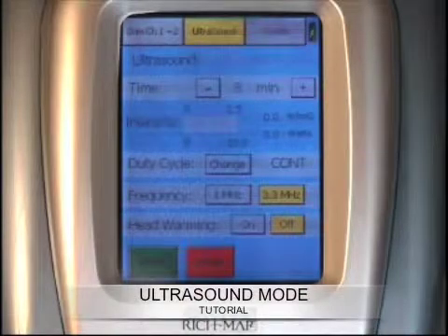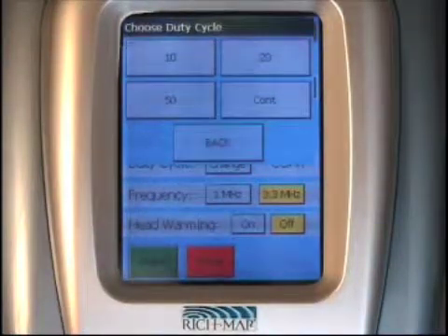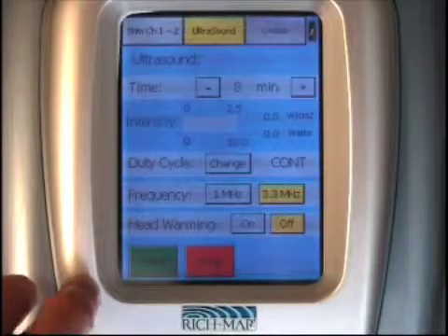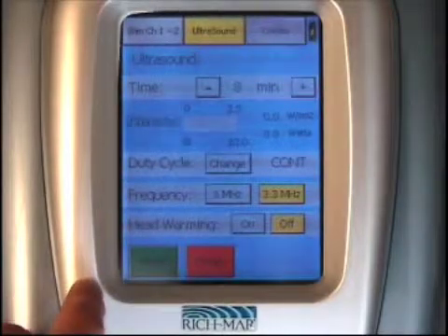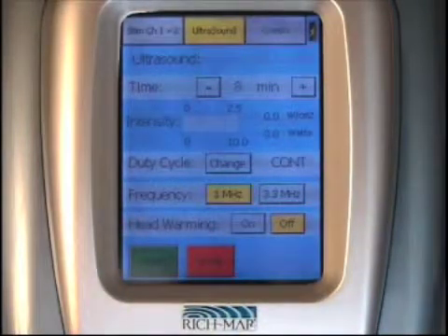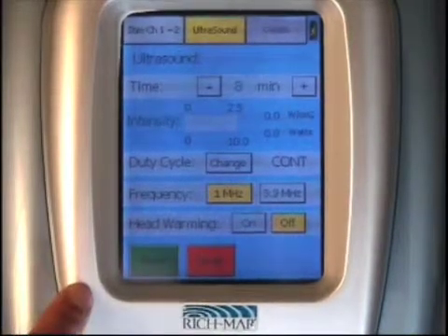The ultrasound side of the Sonic Stem comes in one and three megahertz. By selecting the duty cycle, you hit the change button, and a pop-up menu will allow you to select the duty cycle of your choice. Once the duty cycle is selected, you're able to choose the frequency at which you want to conduct the ultrasound. We will select one megahertz. The head warming feature is only to be used in AC mode when the unit is plugged into the wall. When running off the battery, head warming will not work as it will drain the battery.